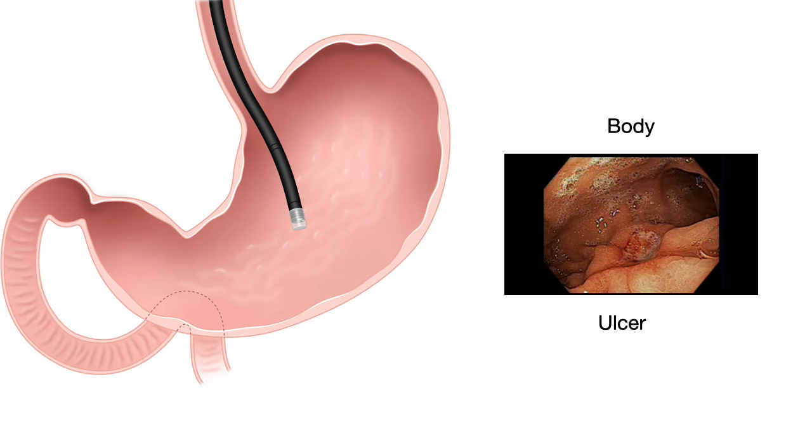So when this is a gastric ulcer, this could be a benign ulcer due to either Helicobacter pylori infection or because of somebody taking aspirin, Brufen, Motrin. Or it could be cancer, or gastric cancer. So every gastric ulcer needs to be biopsied. You biopsy the edges and biopsy the base to see if there is cancer. A minimum of 6 or 8 biopsies should be taken from the edge.